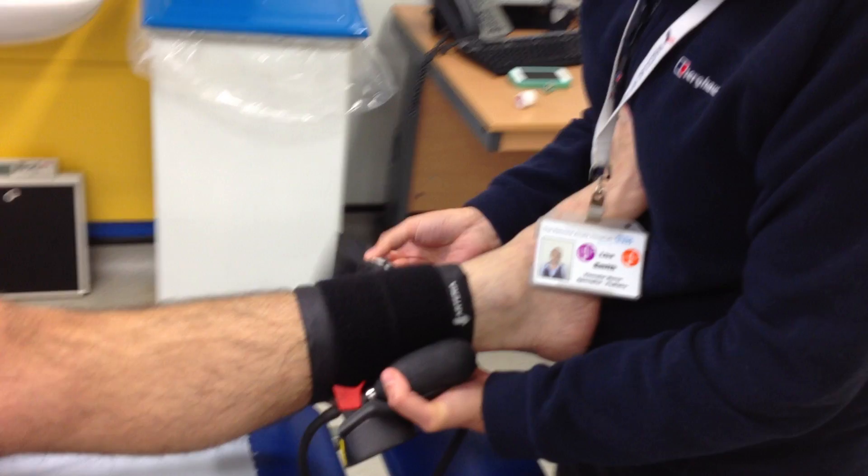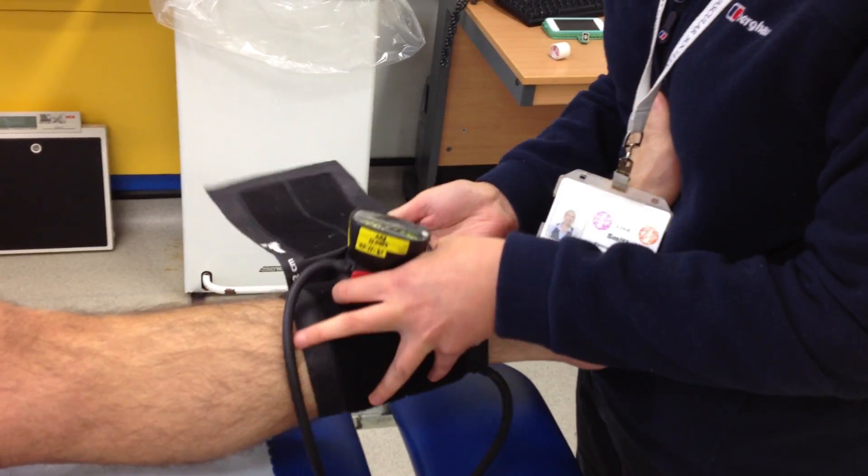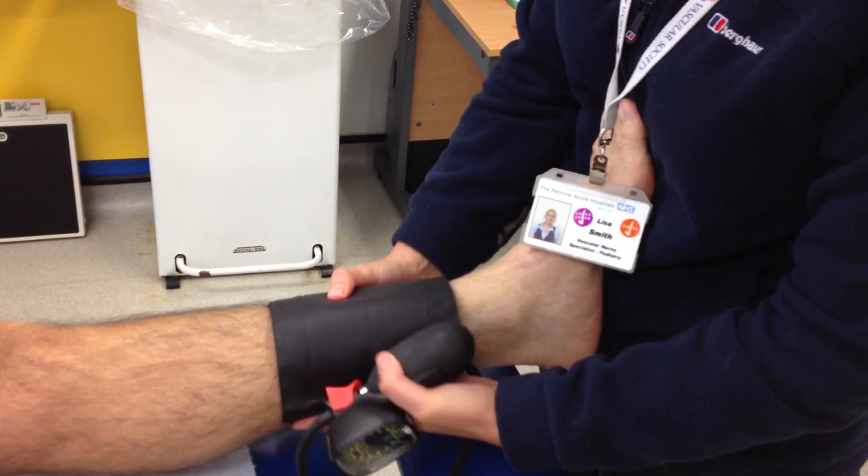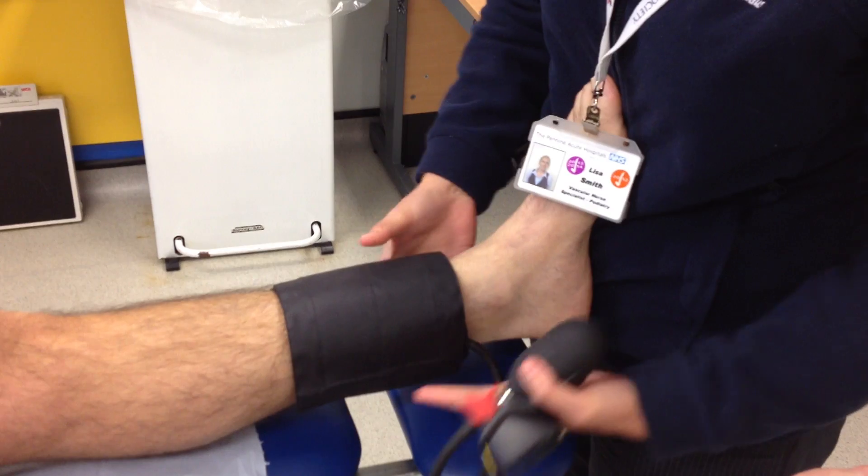The cuff is placed around the lower leg, parallel wrapped again as best as possible, with the bottom of the cuff about 2cm above the malleolus.